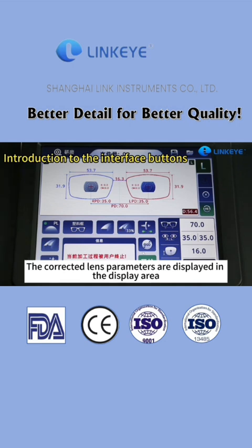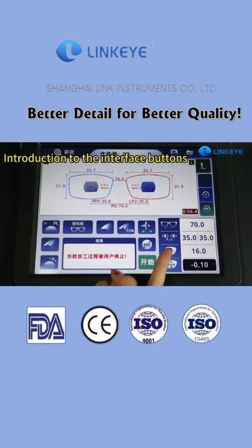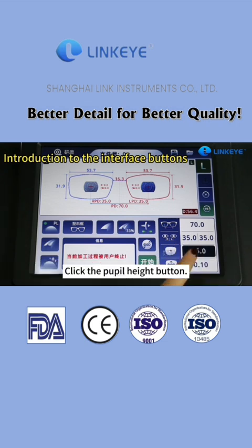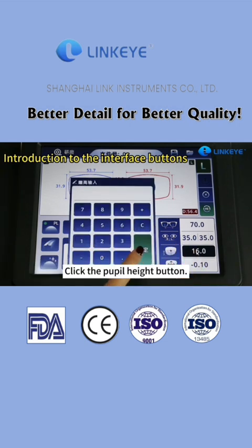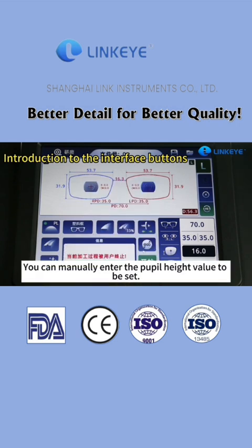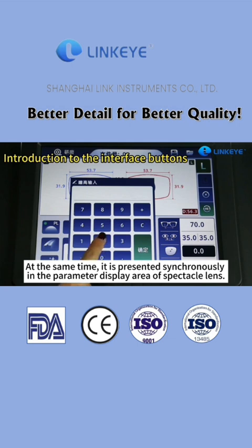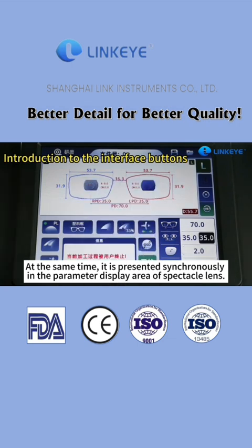The corrected lens parameters are displayed in the display area. Pupil height key. There are geometric center pupil height and lens edge pupil height. Click the pupil height button to switch. Click the data box on the right. You can manually enter the pupil height value to be set. At the same time, it is presented synchronously in the parameter display area of the spectacle lens.